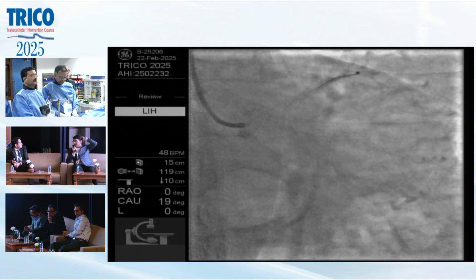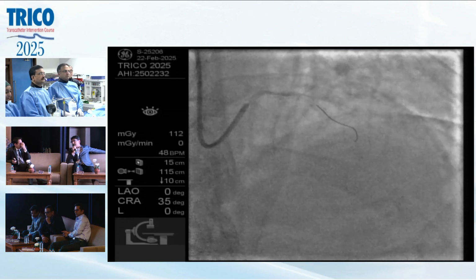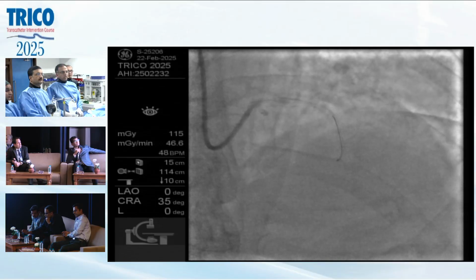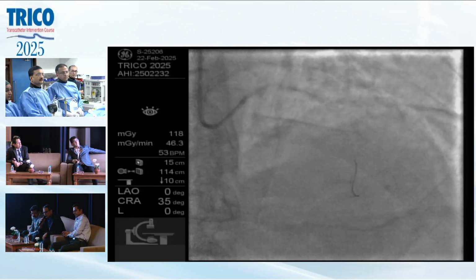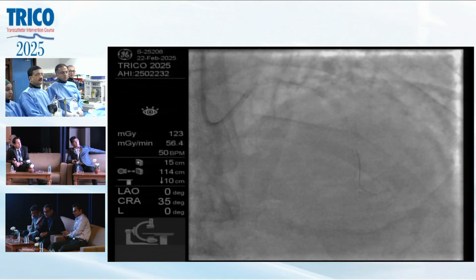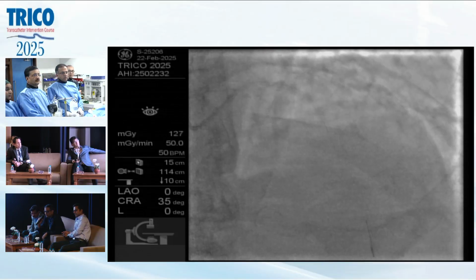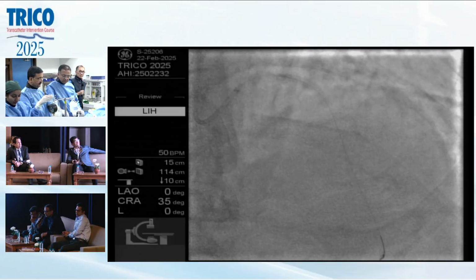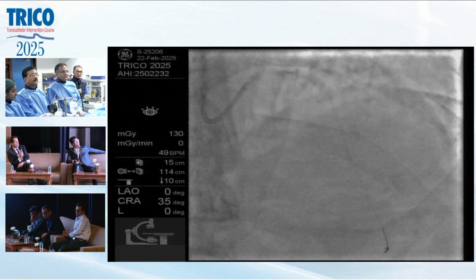So, a neointimal ruptured plaque. This does look like a little bit of a hot lesion, hazy in appearance, more of a soft plaque than calcified. Yeah, but whatever is available on the angiogram, both from the right side and from the left side, there's significant calcium in the left main outside the stent. So I wouldn't be surprised if there was a good deal of calcium inside the stent as well. So we're going to start with OCT so that we can get an idea of what we're dealing with without any doubt.